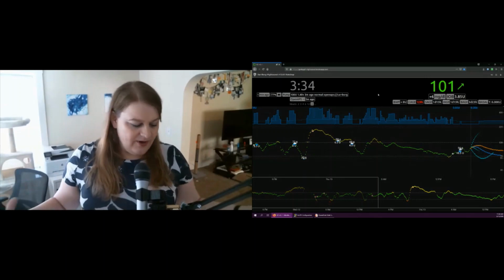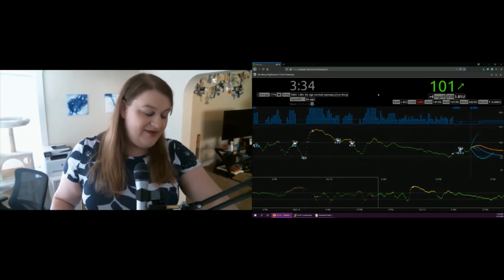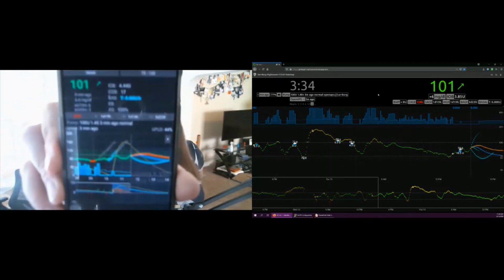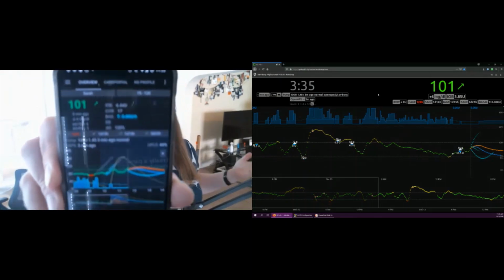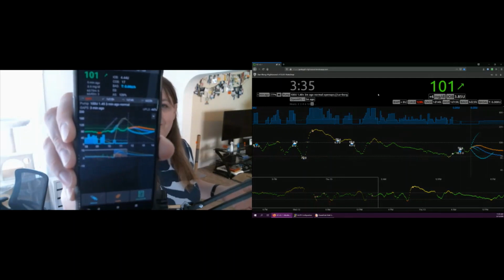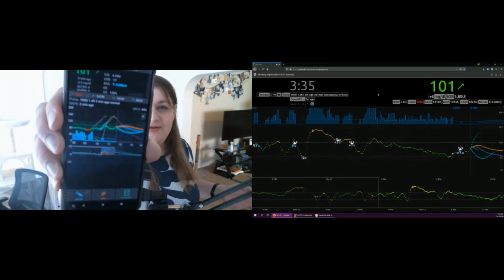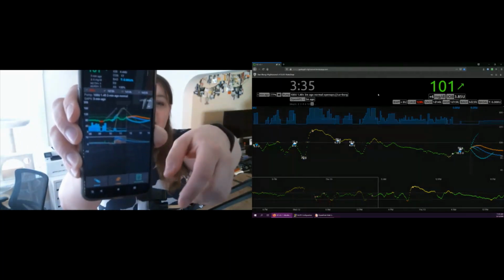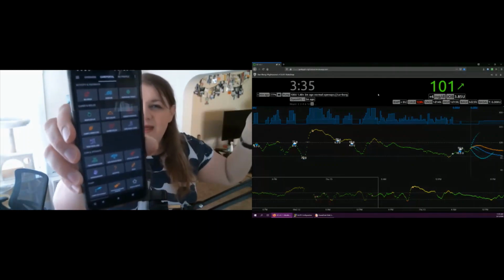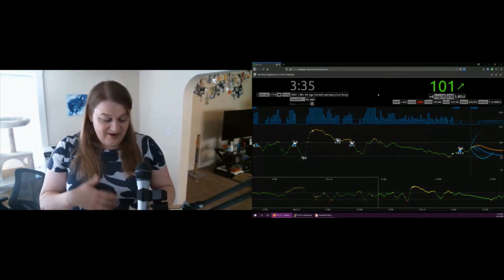So this dashboard is really cool. I like it. I have pretty much all of the same information in the app. So I can see my glucose jumped up to 101. That's really high. I don't know how to fix that. But I can see all of my ages, the temporary basals, the data points, the predictions, the orange over here, the basal rates, all that. And then I can issue different commands and tell it different things over in here. So it's a very cool system.